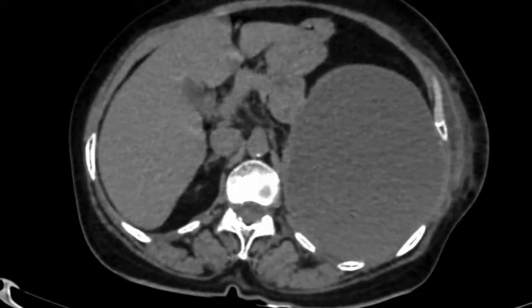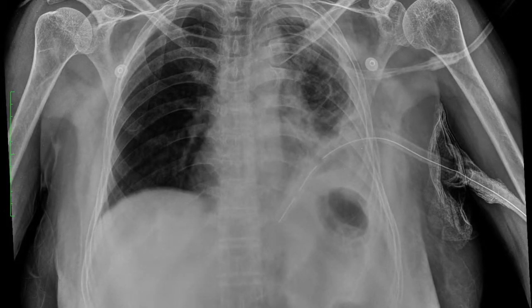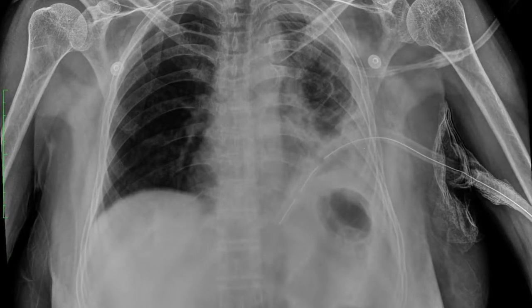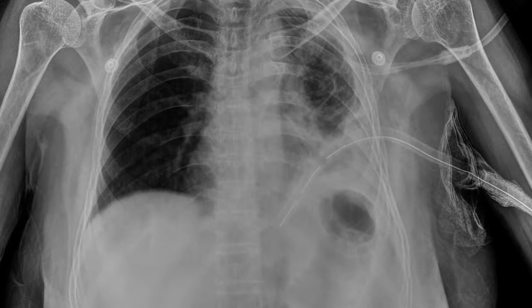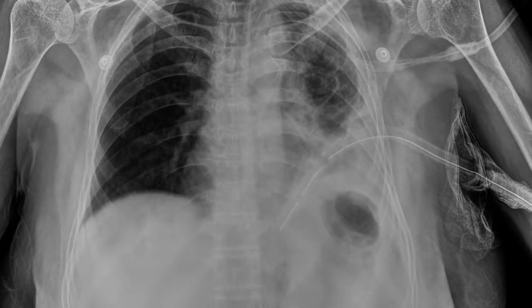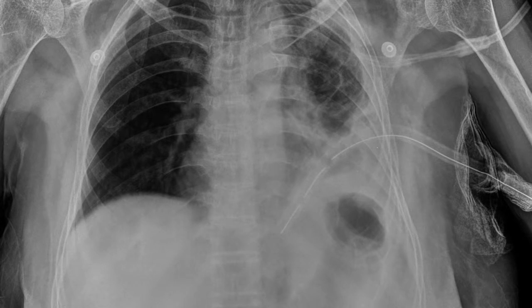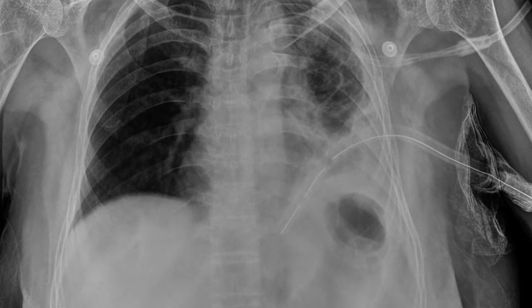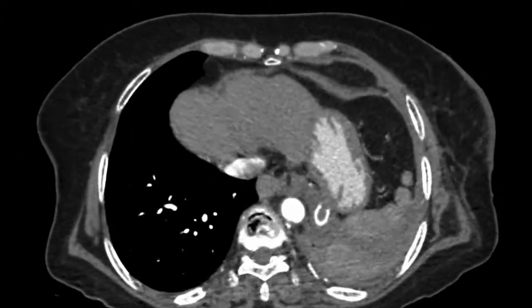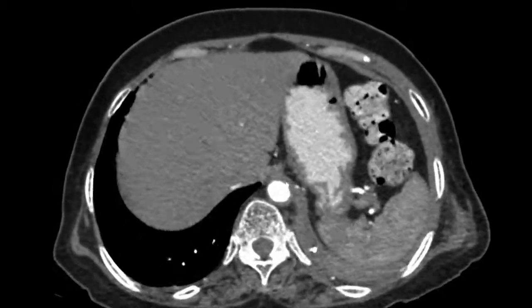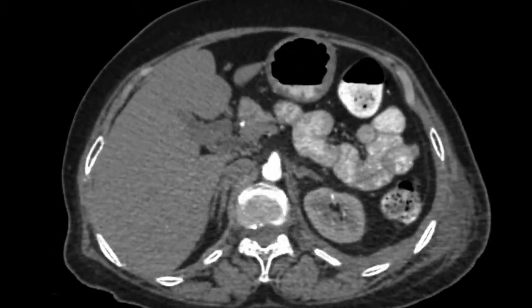We decided to go ahead and treat the patient by performing an intercostal drainage. Once the intercostal drainage was done, we again decided to do a CT scan to look for any endobronchial mass lesion or invasion caused by any tumor, which could have caused the complete white-out — the collapse as well as the consolidation.